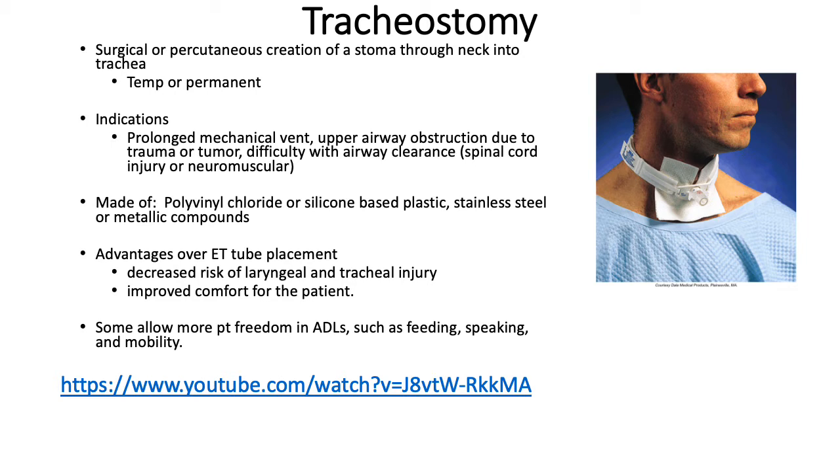The advantages of a tracheostomy tube over an endotracheal tube are that you'll have decreased laryngeal or tracheal injury. In addition to improved patient comfort, the patient will have more freedom in their activities of daily living. They can still eat with a tracheostomy tube in place. Some of them can speak if they have speaking valves and special tubes, and patients can be more mobile. And there is a link to a video on the bottom that you can watch in your downloaded slides. We won't watch it right now.